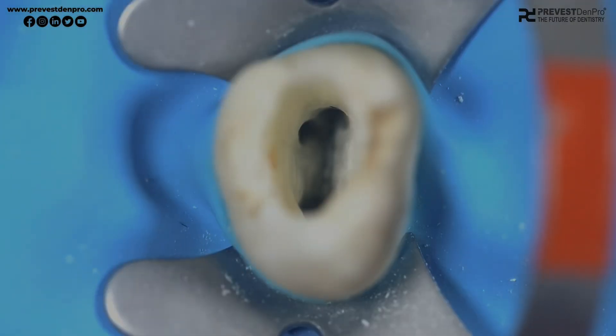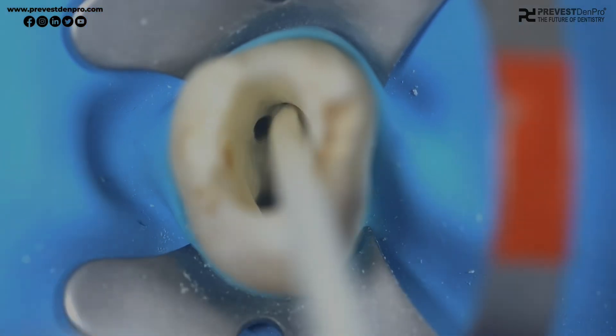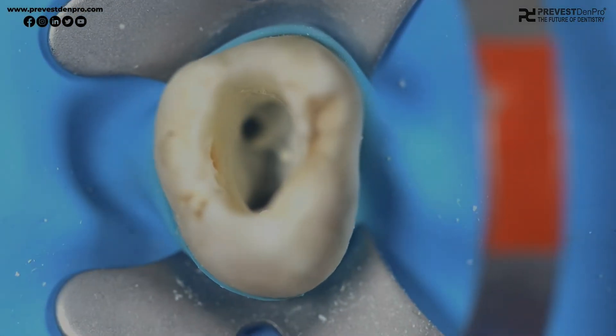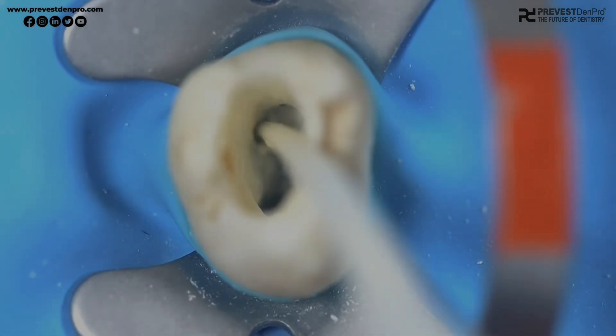Once the canals are ready to be obturated, place the syringe tip into the canal orifice and slowly release or dispense the material into the canals. Simultaneously, use a condenser or plugger to condense the material into the canals. Proceed with the other canals sequentially in the same manner.